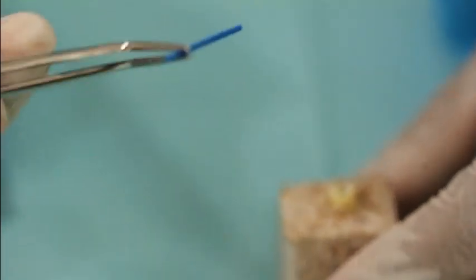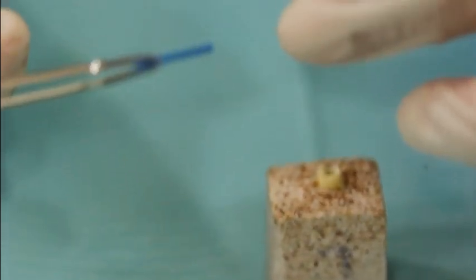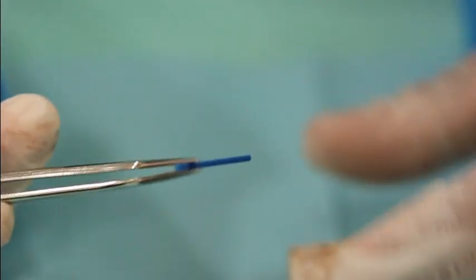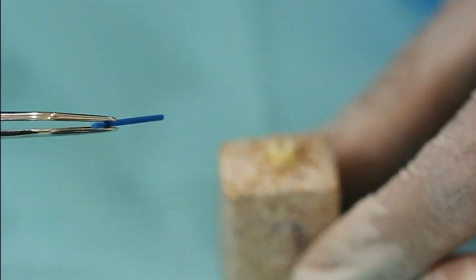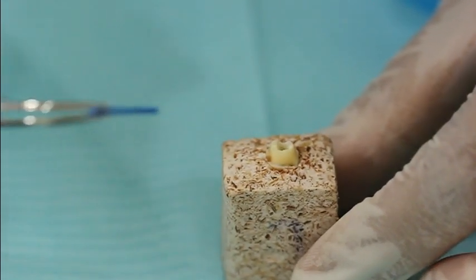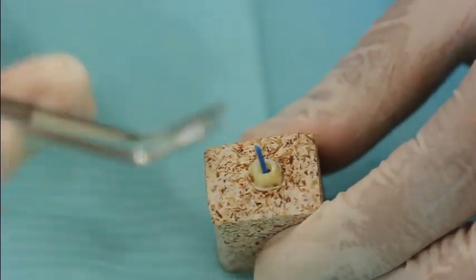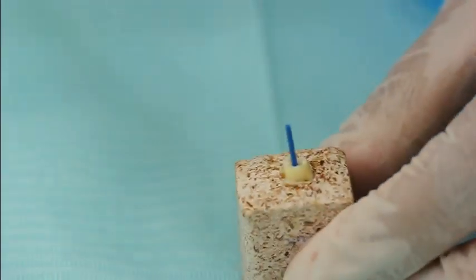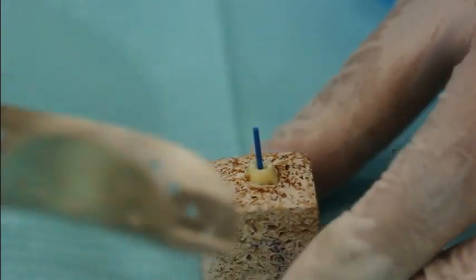Alright, so you need to take this impression post, and the size should be according to the last drill that you used before. In this case, the last drill size I used is the blue color, so you have to take the same color coded one, the blue one. Check the fitting first. And then you have to check with your tray.